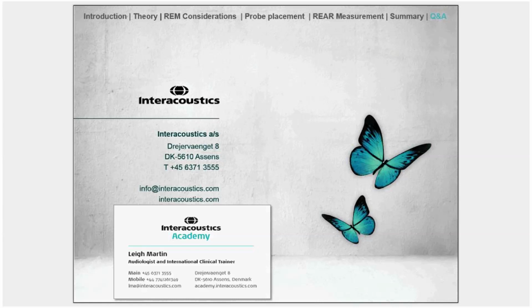Of course, if you want to do a verification such as making sure the directional microphones are working, or if noise management's doing anything, then you could use a non-speech based stimulus to see the effect of what's happening. But when measuring against a target, then I would always use a speech-based stimulus.